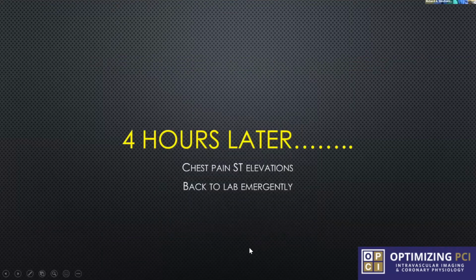And I'm going to go back 4 hours later. The guy's having chest pain with ST elevations, and I bring him back emergently to the lab. And I'm thinking, how could this be? I did this. I opened everything. I imaged everything. If you image, you shouldn't have any problems.